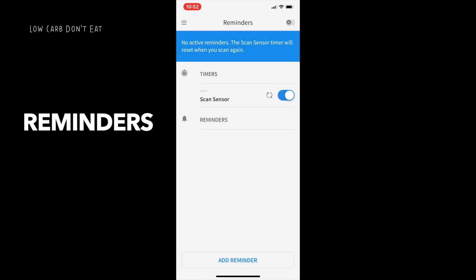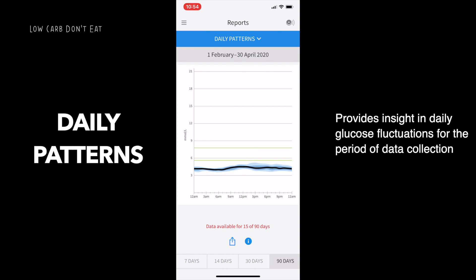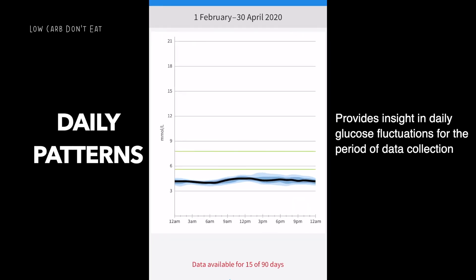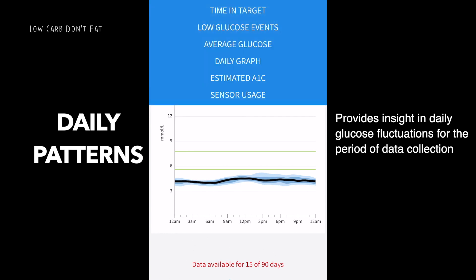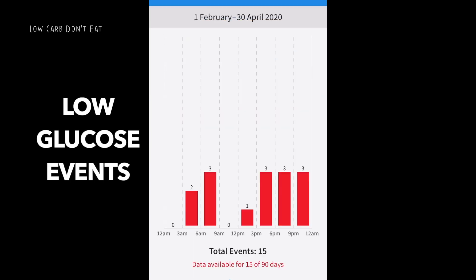The reminder function lets you set reminders so you won't miss any scans. Now let's talk about daily patterns — this is an overall snapshot of the entire testing period showing how your glucose level fluctuates at specific times of the day. Then there's time in target, which shows how long your glucose level has been within a specific range throughout the 14 days. For example, I clocked 83% of my glucose levels between 3.9 and 5.5 millimoles per liter, showing I'm in a good range.